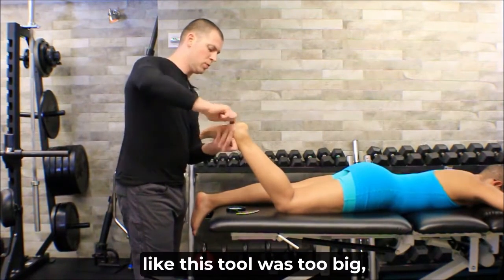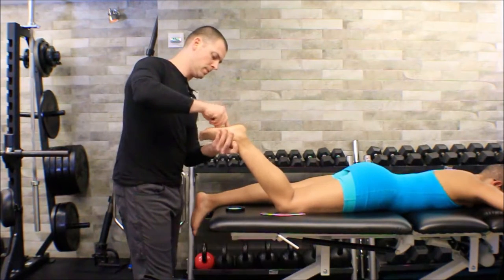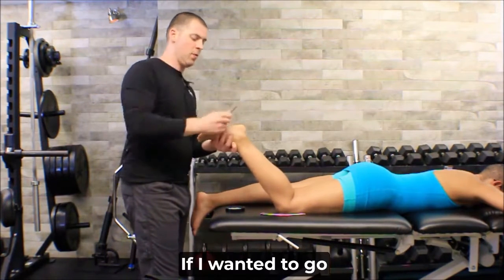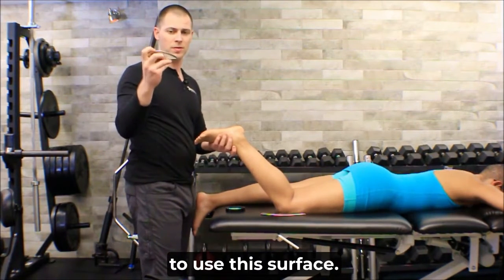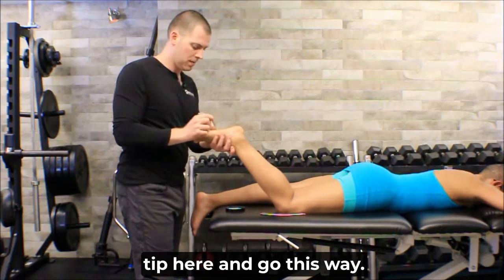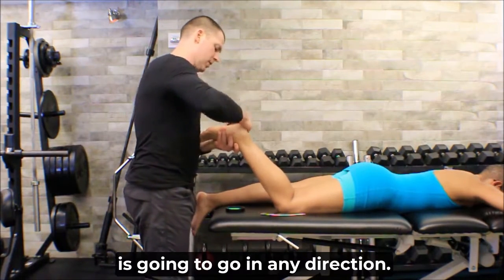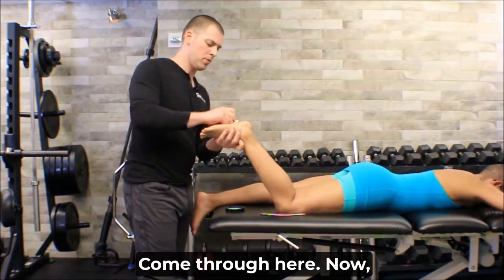If I felt like this tool was too big, I could go to maybe the sharp tooth tool, right? Come in, go that direction, go this direction, right? If I wanted to go across the foot, I'm not going to be able to use this surface, I might have to use just the tip here and go this way. All right, remember the disordered collagen matrix is going to go in any direction. All right, come through here.